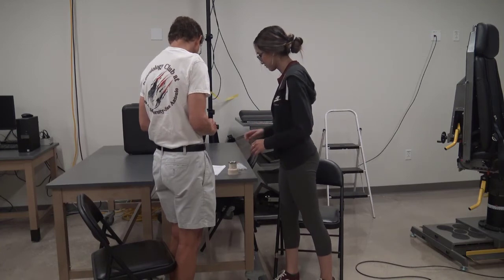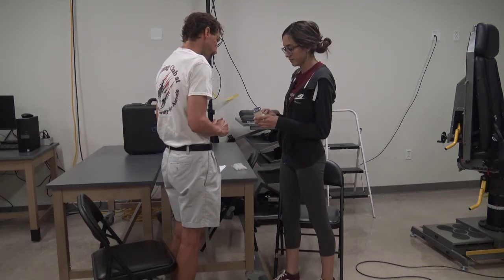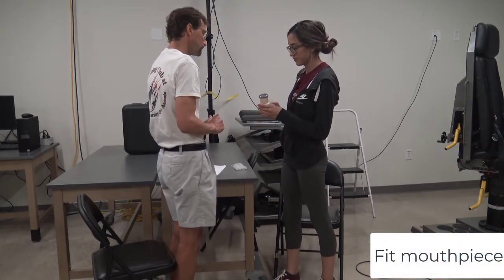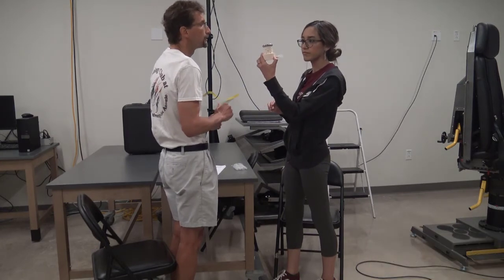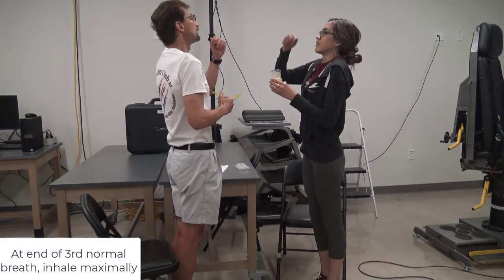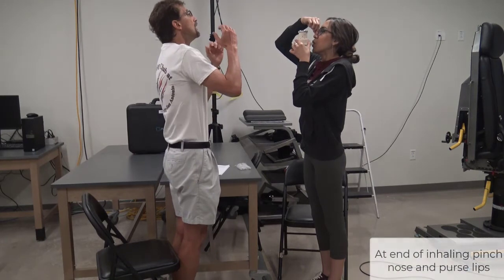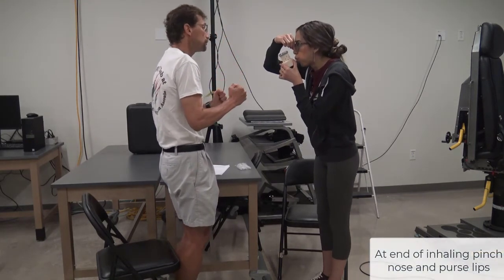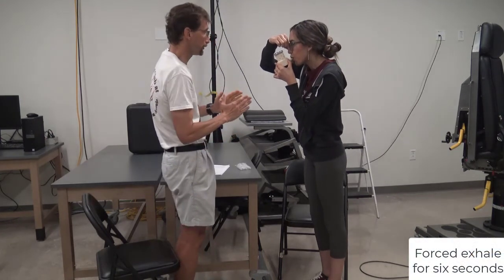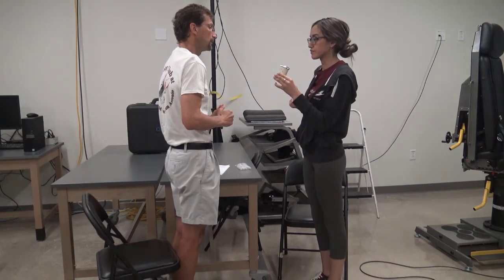Prior to measuring, the spirometer should be cleaned. The client will fit a mouthpiece. These can be plastic or cardboard, whichever comes with it or whatever's purchased, but that will fit right on the receptacle. So when you're ready to measure, have your client take normal breaths, and at the end of the second or third one, inhale as much as possible. Pinch the nose, purse the lips, and blow as forcefully as you can for about 6 seconds. No, really, no less than 6 seconds. Once you're finished, then you read the dial.